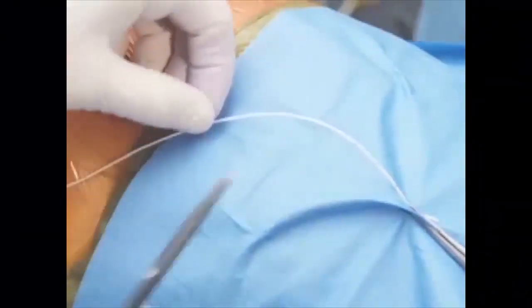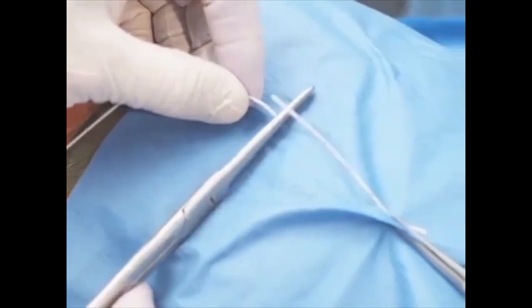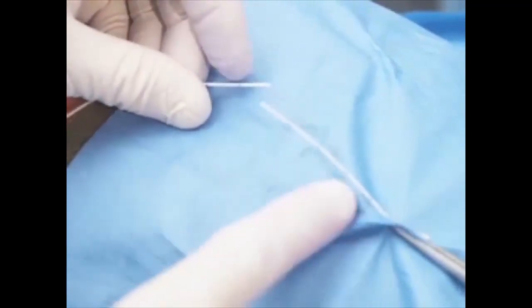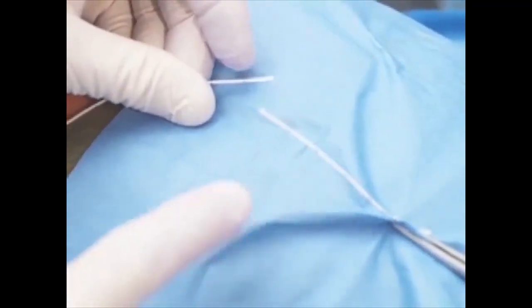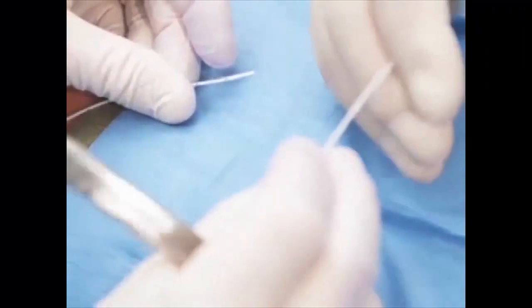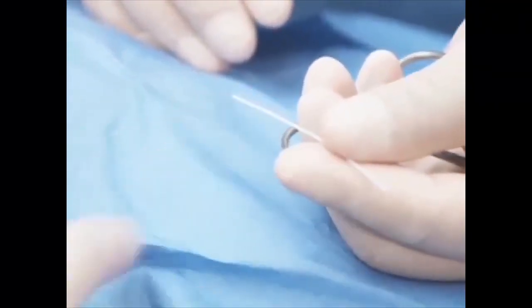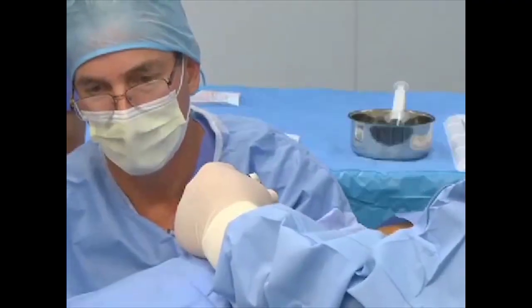Unclamp the catheter and trim the clamped or excess length of the catheter spinal segment as necessary, leaving at least 5 centimeters outside the fascia entry point to permit catheter connection and to allow slack for patient movement. Save all pieces of trimmed catheter tubing to perform length measurements and volume calculations at the end of the procedure.